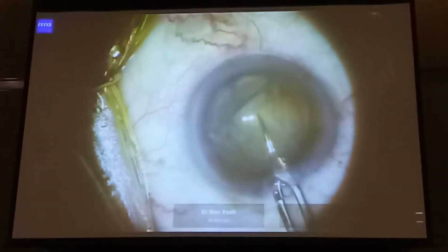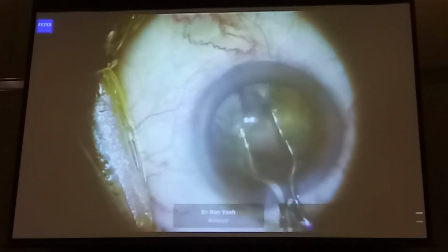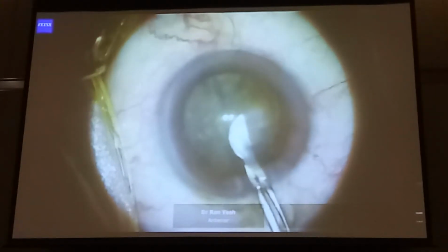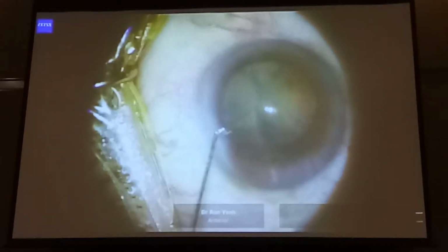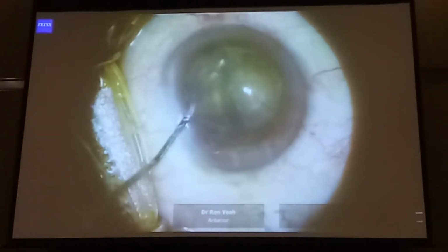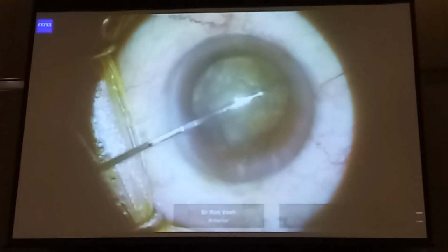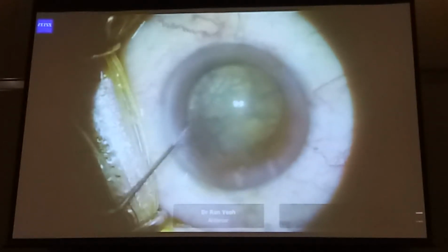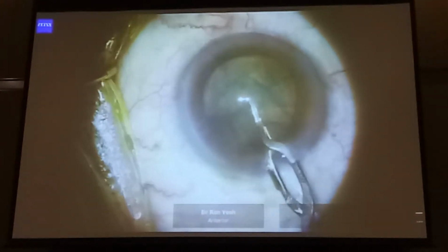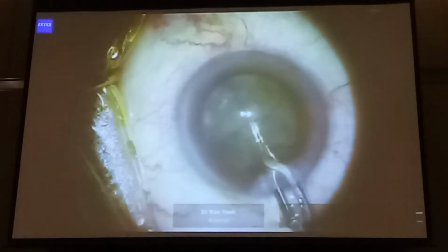Again, this is an 80-year-old patient with a 3+ nucleus, goes straight in, cracks into half without using any phaco energy at all. And now sometimes if you cannot rotate the nucleus or you're worried about hitting the subincisional CCC, nothing to stop you putting a second instrument in and just rotating the eye. But that's where the hydrodissection is very, very important, and then you just go back in and complete your 4 quadrants with this. You can of course crack this into 6 pieces if you want, but 4 is usually adequate for most cases.